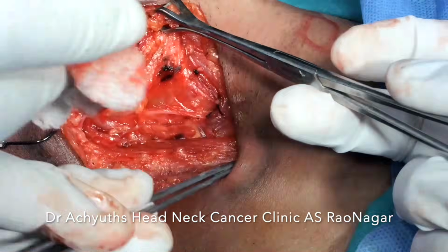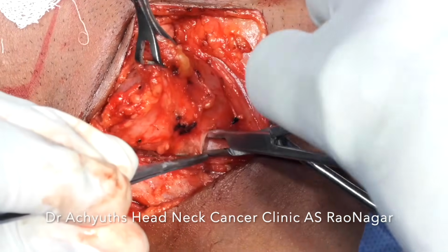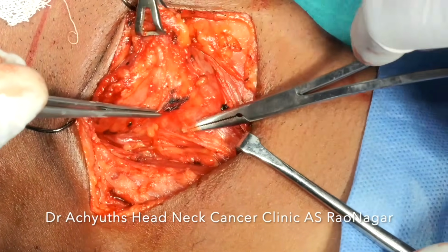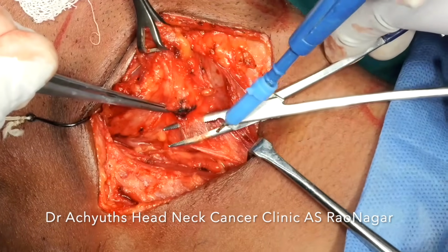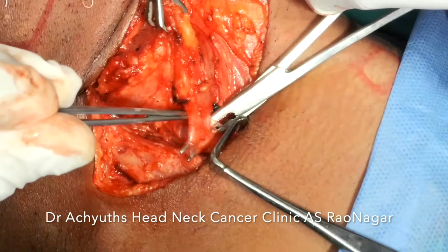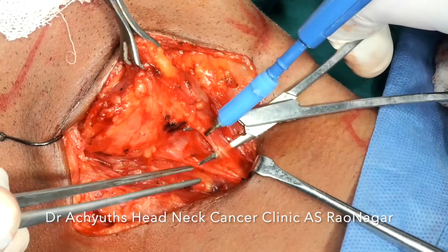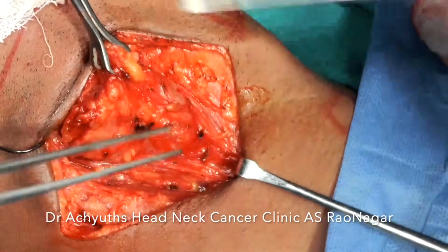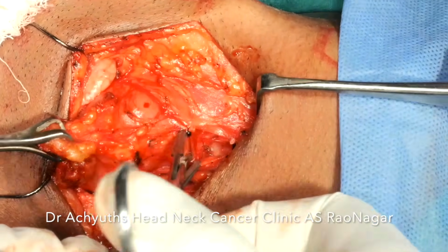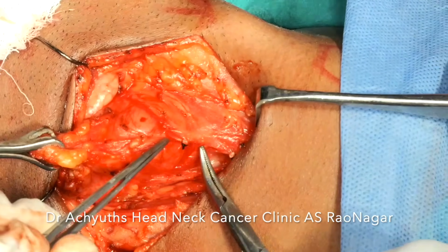Now slowly we are able to deliver the cyst from its attachments. So the neural structures here we encounter are the descendens hypoglossal, the ansa cervicalis, and if the carotid sheath is opened, we will see the vagus. So whatever it may be, any of the neural structures need not be compromised here. They can be conveniently and comfortably preserved.